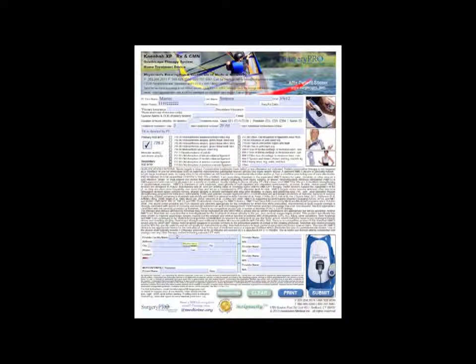Provider facility, I would put in my information. I've got checkboxes here, so if I have a series of providers, and I'll talk with you before the end of the video about setting that up, but I fill out my information. Again, I'm tabbing through, entering, and then finally I've got a signature field, a clear field, a print field, and a submit field, and then a couple of additional providers.